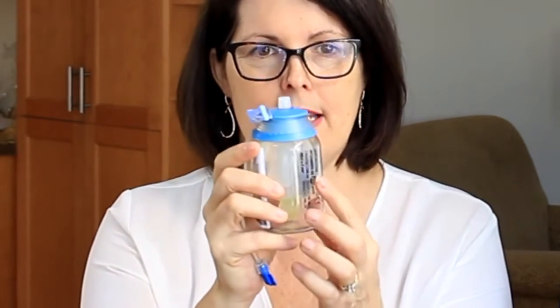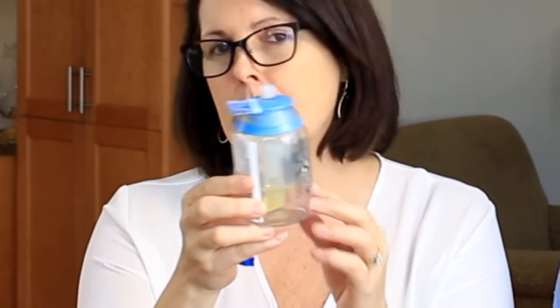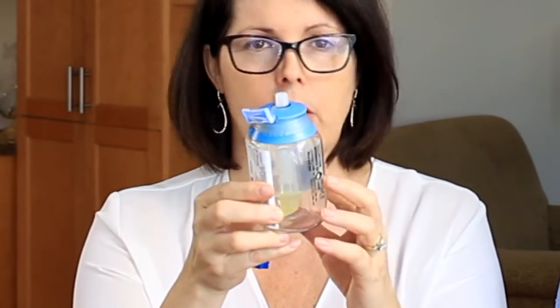This is the Intermate pump, which kind of looks like a baby bottle. In fact, that's what some patients affectionately refer to it as. It has one dose of medicine in it. So if you get your medicine once a day, there would only be the one dose. This will run for, depends on the bottle, maybe a half an hour to an hour and a half. They do vary. But your pharmacy will send you the bottle with the right speed.